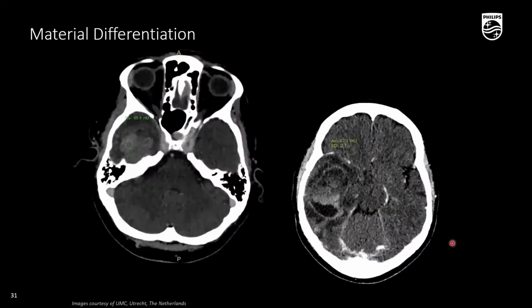Okay, and I think the last one before I start on MSK is differentiating between materials. So I'd given that example on, is it a cyst or is it iodine uptake? A common problem is after a surgery, an intervention, usually a mechanical thrombectomy to remove a clot in the brain. We might see something like this, and the hyperdense region, it's a non-contrast scan, so would indicate that it's a bleed, but the patient just had surgery and just had a contrast scan, so it could actually just be residual contrast, and we can't really tell the difference here.